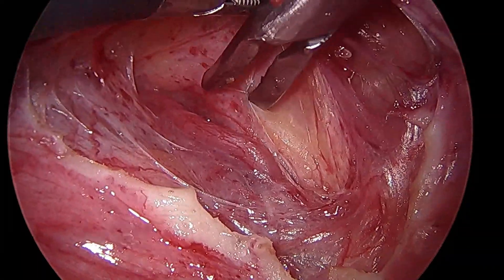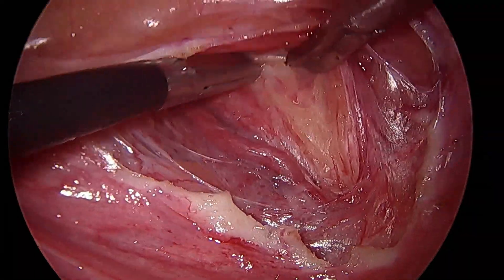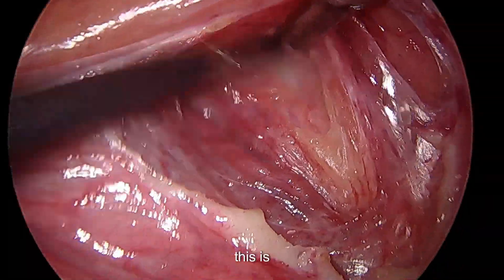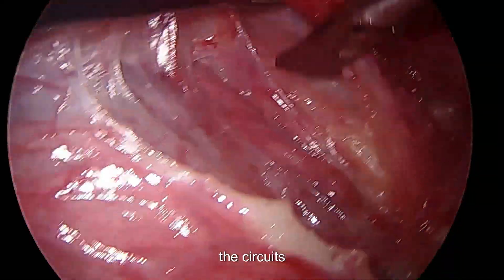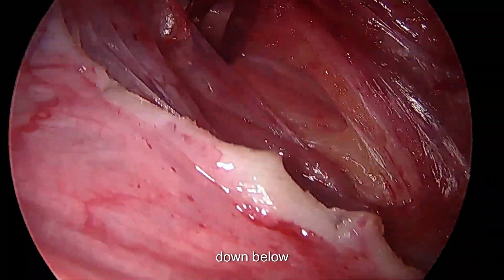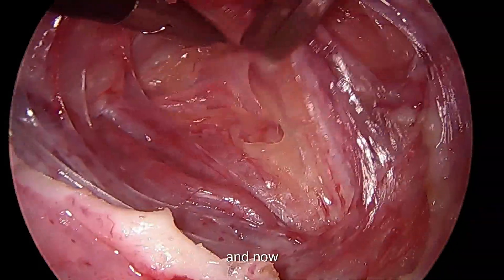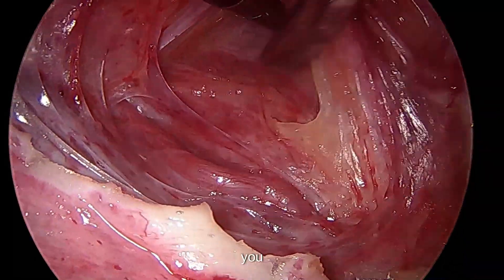And this is it. Put on this tape and you will end up on the surface. You see this? You see the surface? This is the surface. And if I go down below, I will be on the opposite end. So I just have to follow this tape. And now you realize here, that is not adherent anymore.